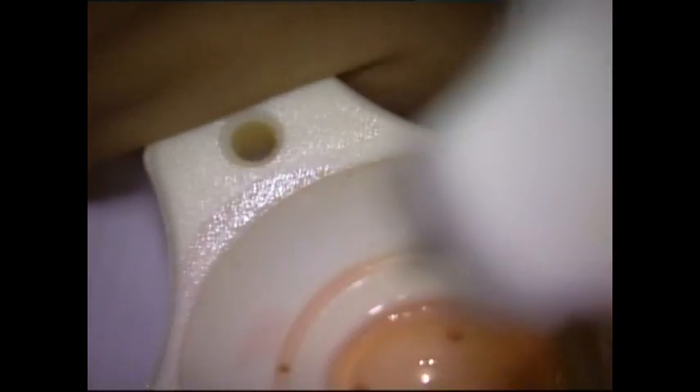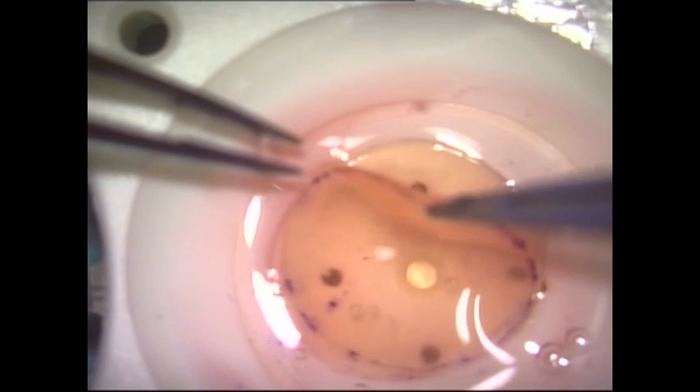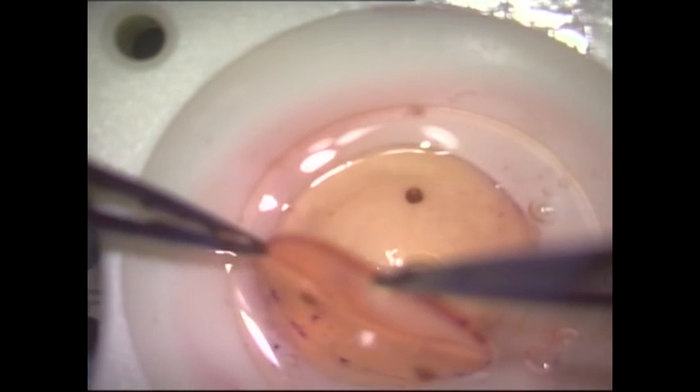The donor tissue is then transferred to a Teflon block and punched to the desired diameter. By using these simple tips, you can easily perform manual dissection and obtain optimum tissue thickness while avoiding complications. Thank you.